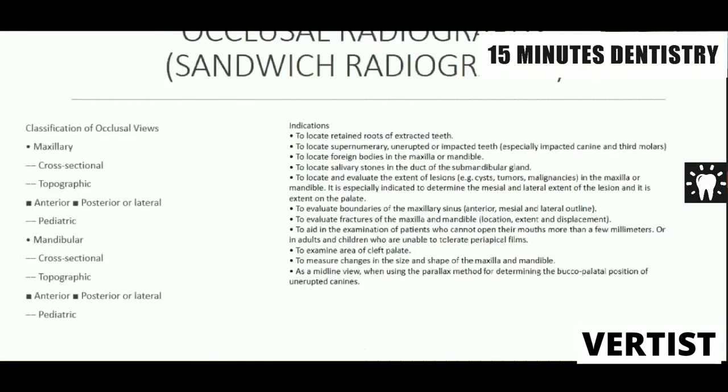Occlusal radiography or sandwich radiography. Now this is taken to locate retained roots of extracted teeth, supernumerary teeth, foreign bodies, salivary stones, and especially for the expansion of the lesion. Now, occlusal radiography is classified into maxillary occlusal and mandibular occlusal. It is further classified into cross-sectional and topographic views.